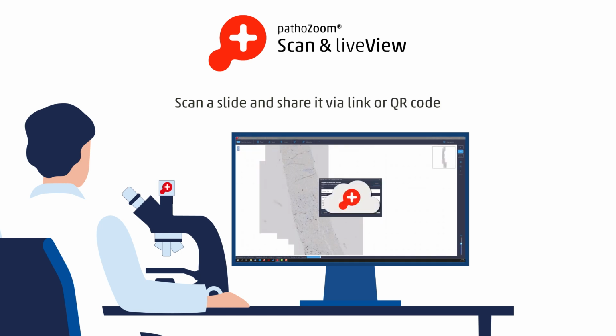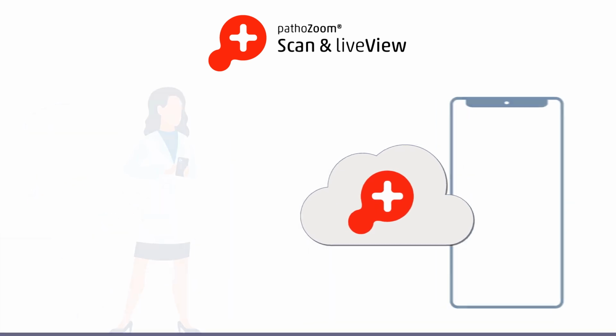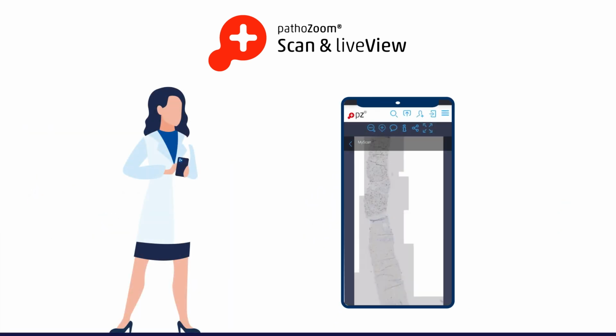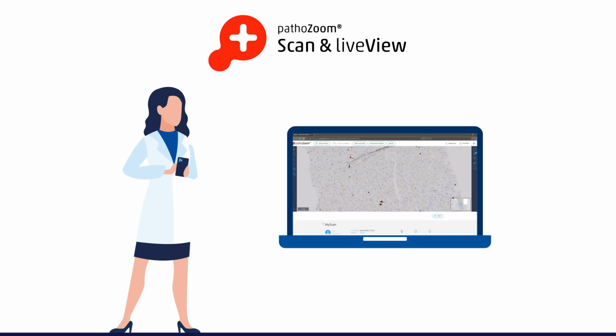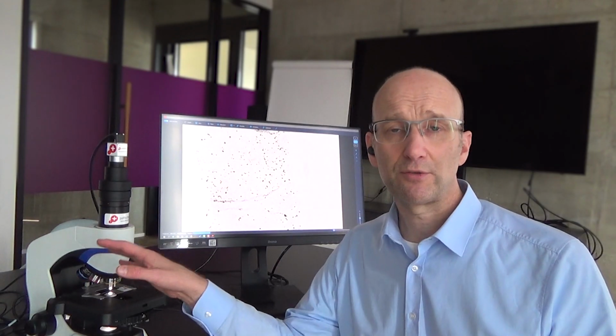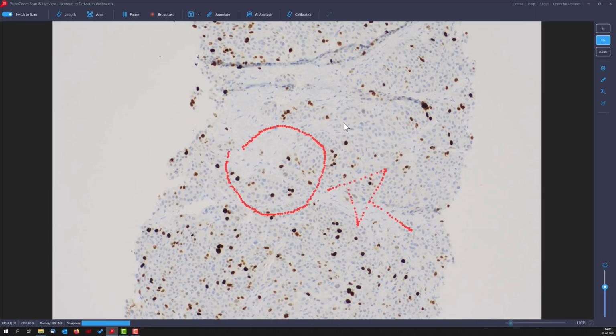to the PathoZoom slide cloud and share the entire slide just with a link to your colleague. When your colleague has then time, he or she can review the slide and give you feedback. With PathoZoom Scan LiveView, communication in pathology becomes so easy.